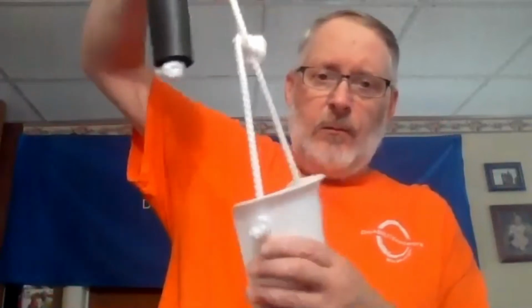And the last thing I have for you out of the hip kit is called a sock aid. What this is, is a piece of sturdy plastic that has a little foam thing on the front of it. And what this does is you put your sock up over it all the way up to the top, and then you stick your foot into your sock, and then it has these ropes right here that you pull your sock up. Once your sock's up and your toes are actually at the end of your sock, this little felt thing would release your sock so that your sock would stay up on your calf.